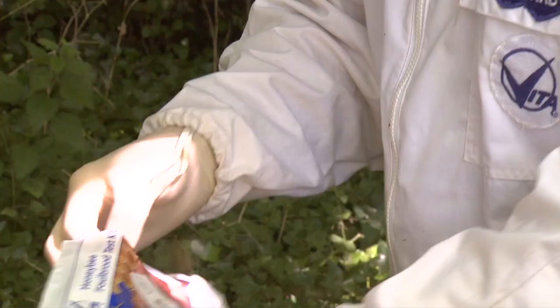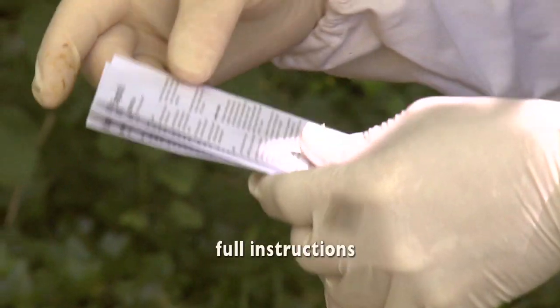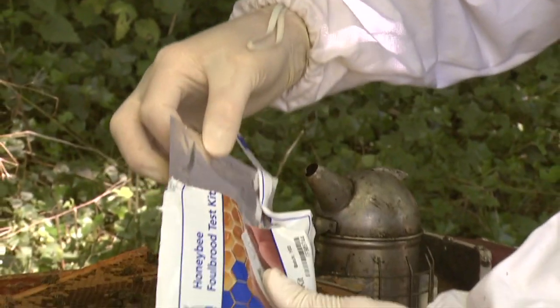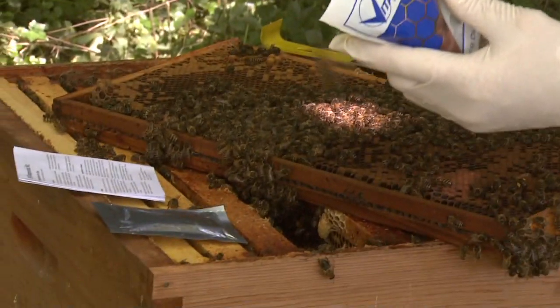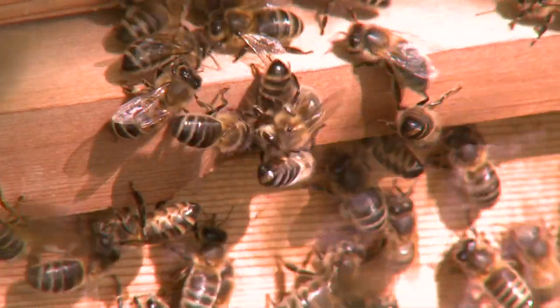So we have developed a kit based on monoclonal antibodies, rather like the pregnancy test kit, which is very fast and highly accurate. The kit comes with full instructions and has everything you need for the test.